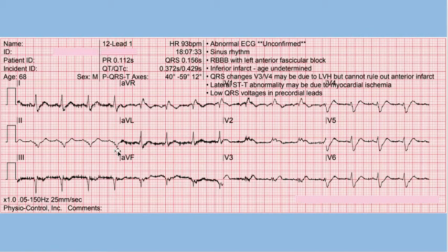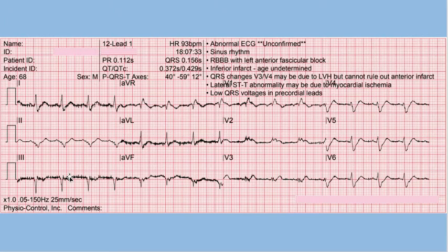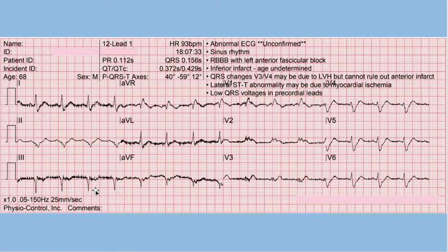Moving over to the frontal plane, here is that lethal combination: a leftward axis. The computer is measuring it at negative 60 degrees, so this is a left anterior fascicular block. Even though there's a lot of artifactual fuzz with this bandwidth of 0.05 to 150 hertz, you can still see J point depression appreciable in AVF and lead III, with some beat-to-beat variability, but nonetheless ST segment depression. All of this in combination is indicative of a proximal LAD occlusion.